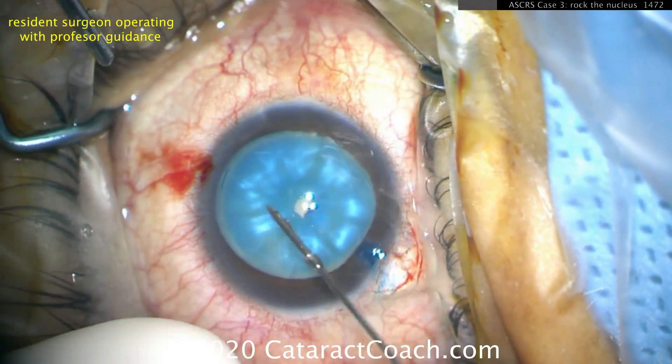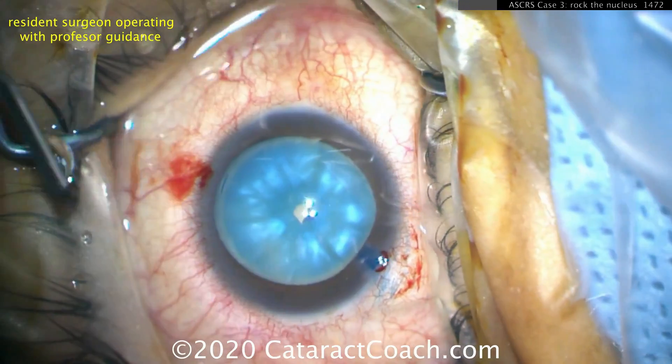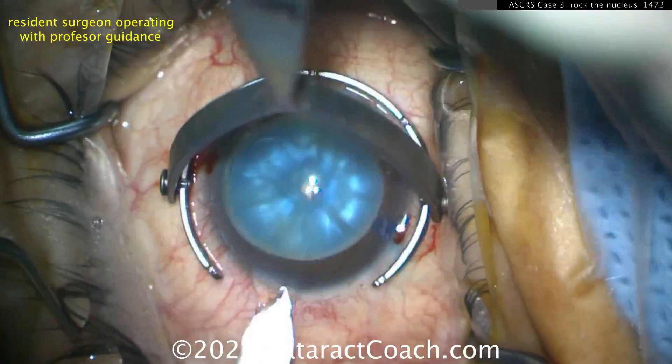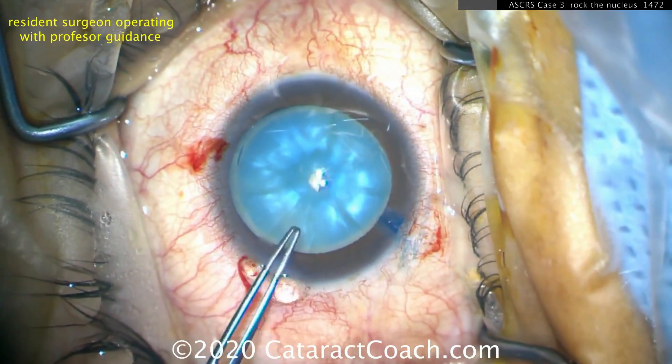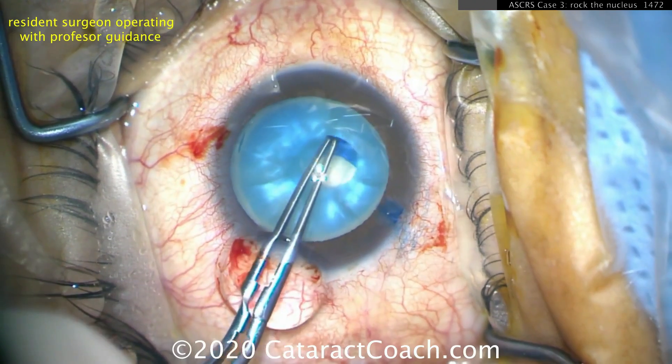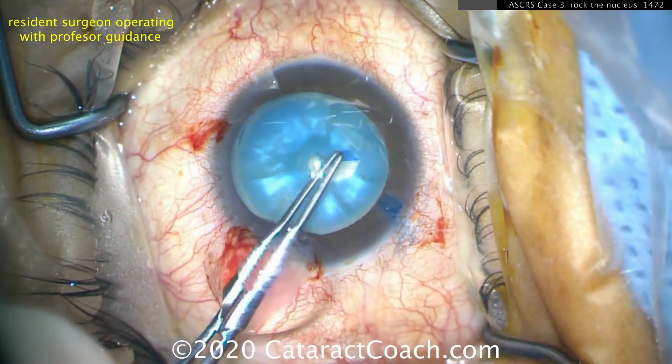It's also behind the nucleus. Here's a case — decompressing and getting some of that fluid out, and you can decompress it even more. By decompressing it, the pressure in the AC is going to be higher than the pressure in the bag, and as a result, you'll be able to have good control to get a rhexis done.